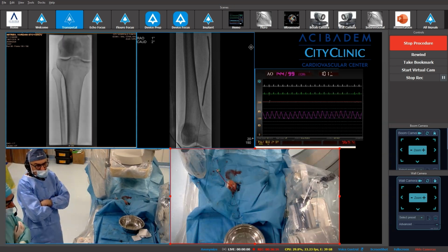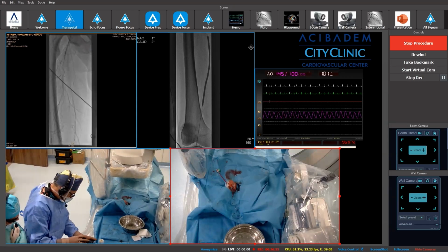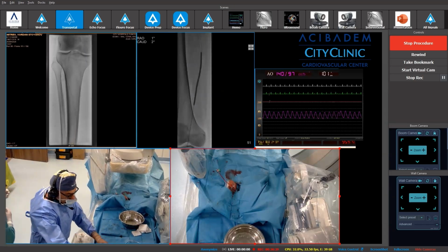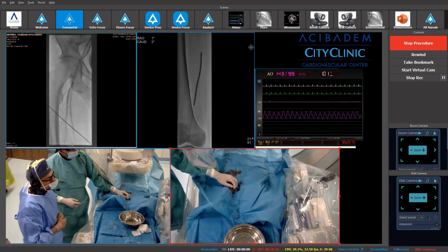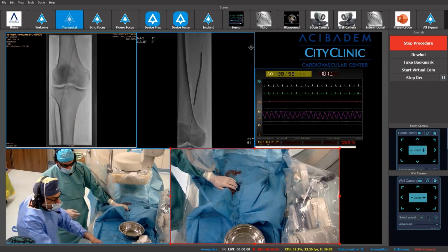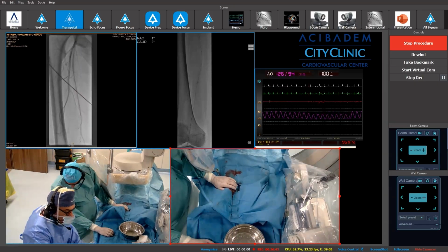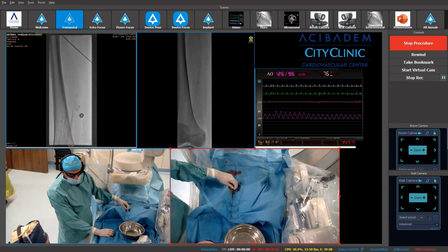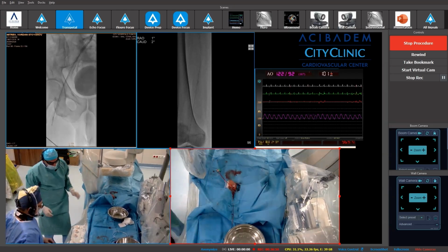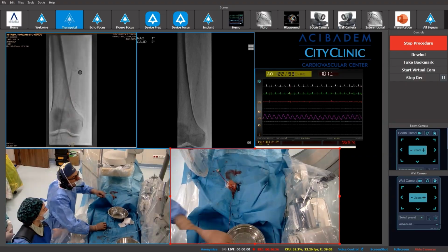By the way, this is a very good remark. The dilution of the contrast in the inflation device is absolutely crucial. And our practice is not to use a one-to-one ratio, saline to contrast, but to use 70% saline and 30% contrast. Because with nowadays angiography machines, everything is much better visible and we don't need so much contrast in the inflation. Okay, that's a very good point.